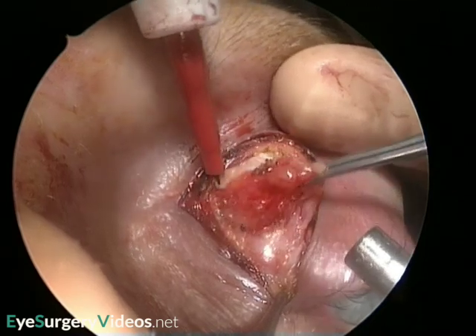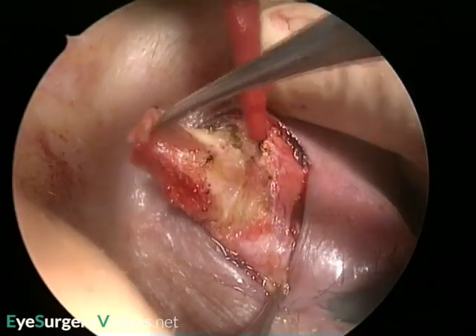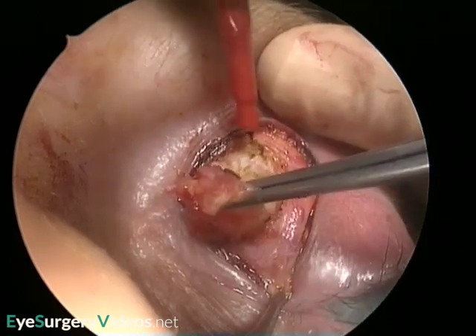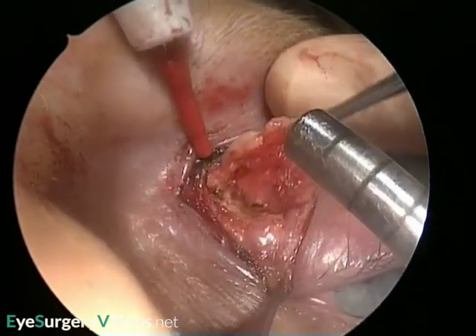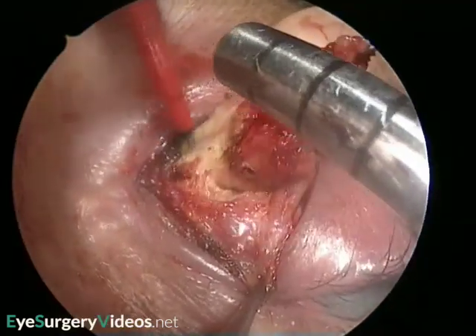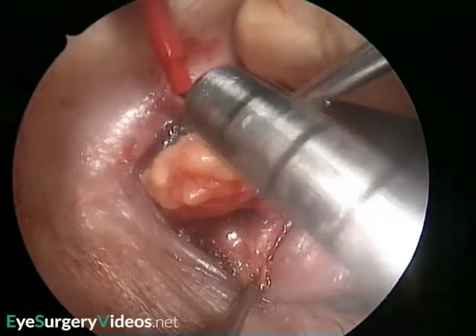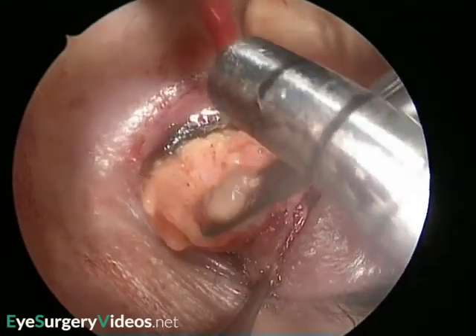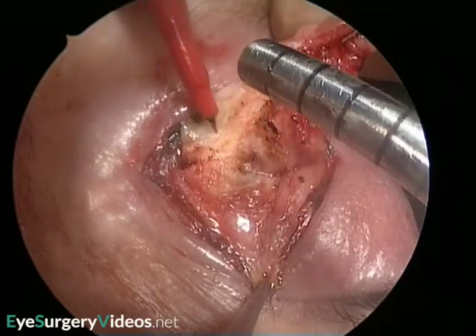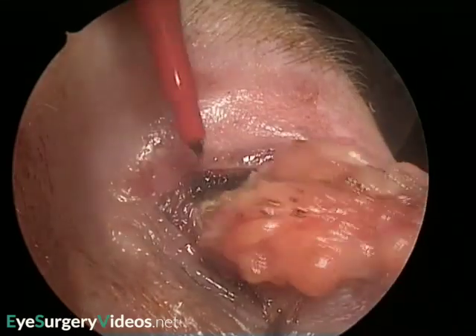The fat is placed in a syringe so that it can be measured and compared to the other side. The supralateral fat, which is a darker yellow colour, can be excised. However, the potential gains are less with the smaller volume of accessible fatty tissue, and the risks slightly higher as great care has to be taken to avoid injuring the lacrimal gland and its ductules.